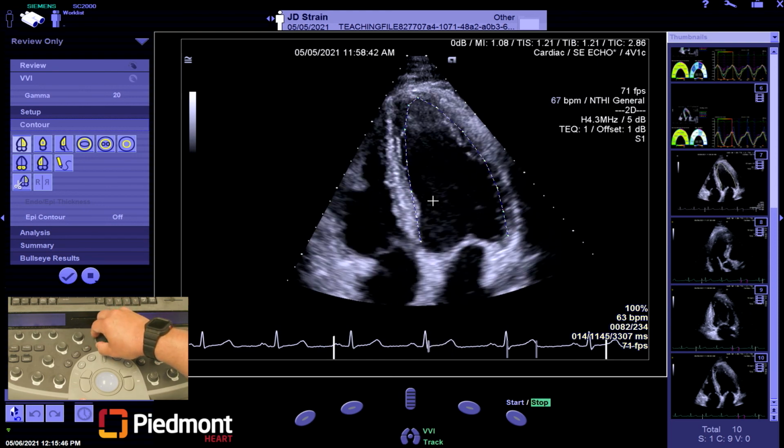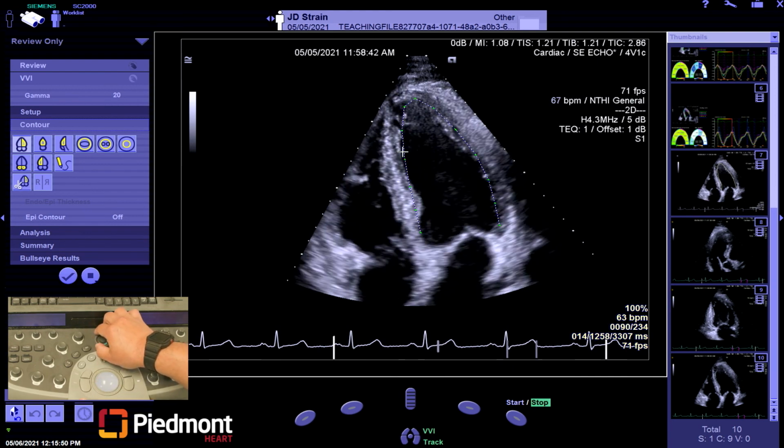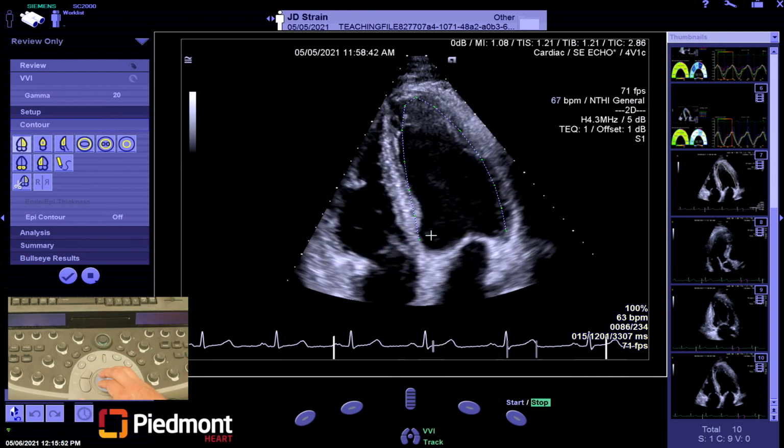You can really see, even though it's slightly off from the endocardium, it actually is moving fairly well. But we'll make some subtle adjustments here, bringing this point out, and that's a simple right click on the green dots, and then we'll bring these slightly out, so it's a single click to grab, and then just a slight movement. Single click to grab and slight movement.